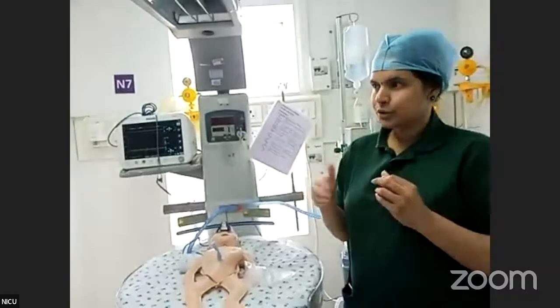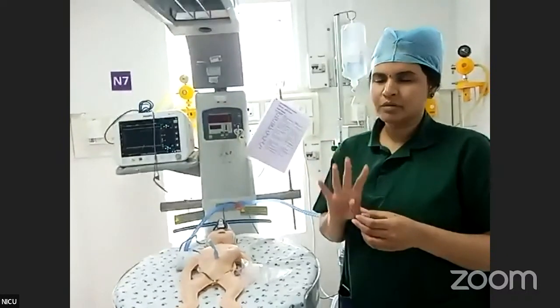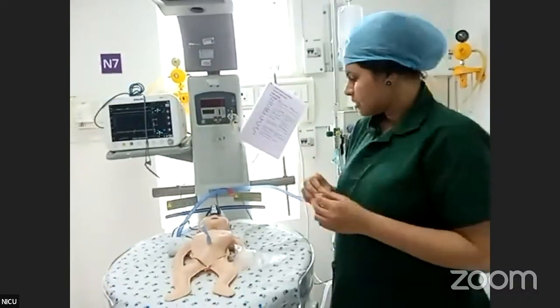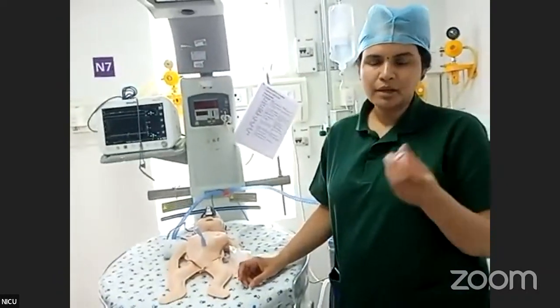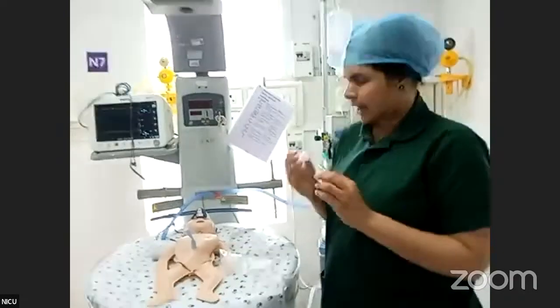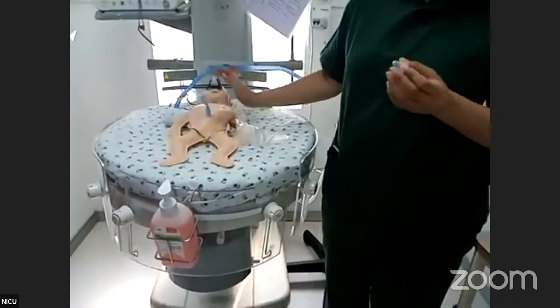So, there are 9 to 10 different sizes represented by permutations and combinations of these 2 numbers. So, each prong will be identifiable with a 4-digit number. First 2 digits represent the nostril size, last 2 digits represent the width of the columella. So, we also have nasal mask, which is available, I think, in 4 sizes in the Fisher and Paykel. And based on the make, like for example, in Breger or Mackey, again, we have different sized nasal masks. And that size of the mask that optimally covers the baby's nostril without impinging on the eyes and the mouth is taken as the right size for that particular baby.